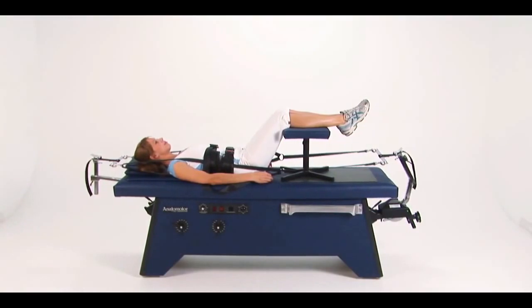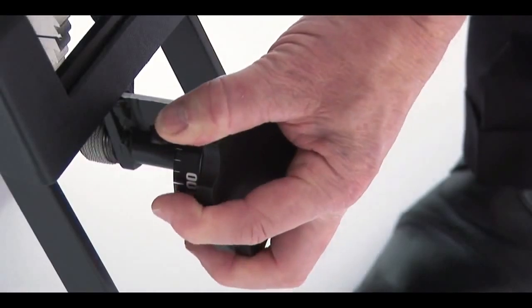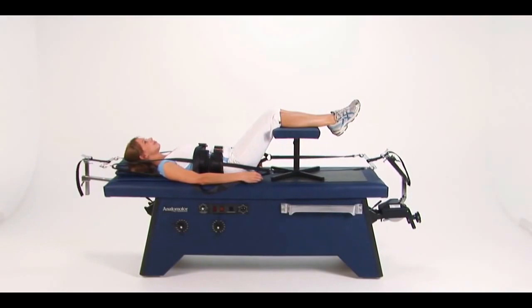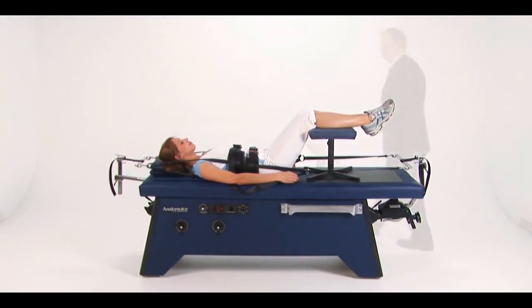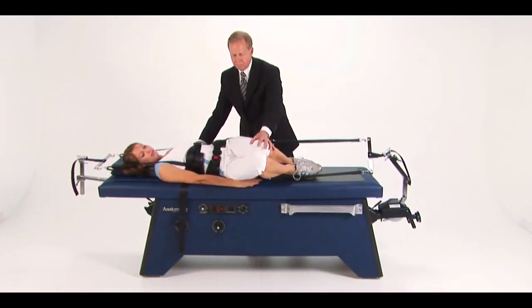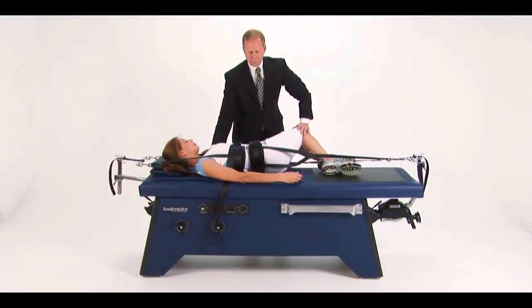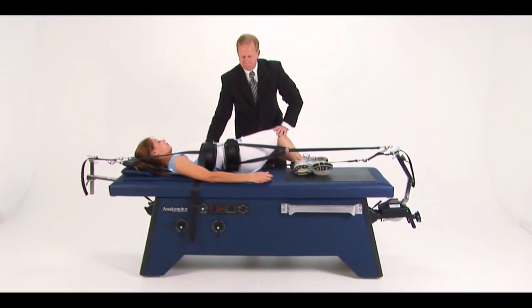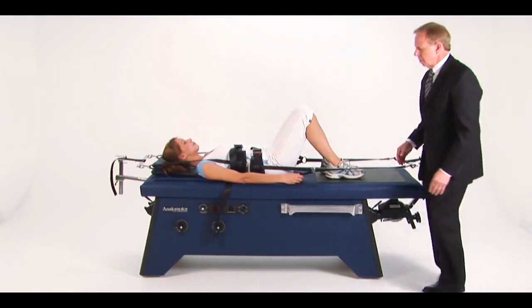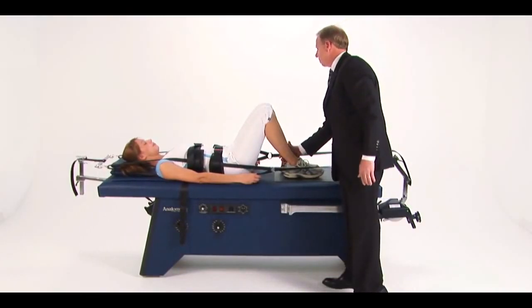Adjust the poundage during the rest cycles of the traction, when the table is returning towards the traction control unit. Usually about half the patient's body weight is adequate for lumbar separation. However, it's always advisable to palpate the area, then adjust poundage as indicated. During traction with the Anatomotor, you can rotate the patient. Rotating to the right isolates traction force on the left side. Rotating to the left isolates traction force on the right side. Further, you can stop the table at any time to perform manipulation under constant traction.